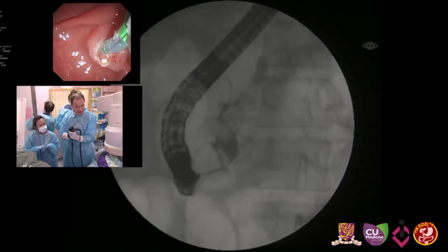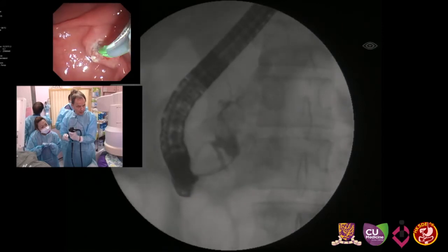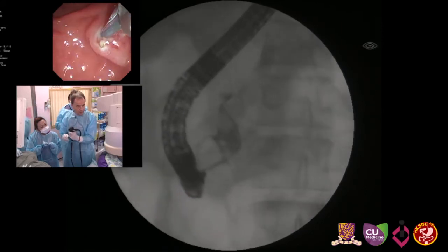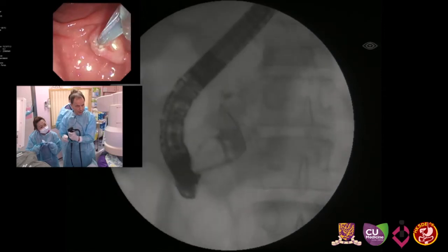Now you are in a side branch. Yeah, but maybe it will bend out. Really, you bend. So I follow with the sphincterotome, pull it back. Pull back. And push again.